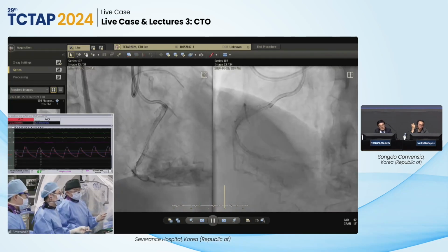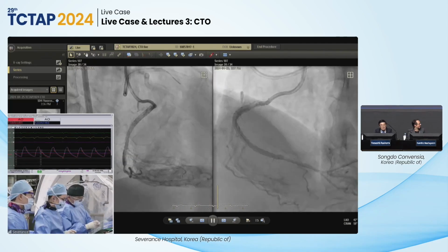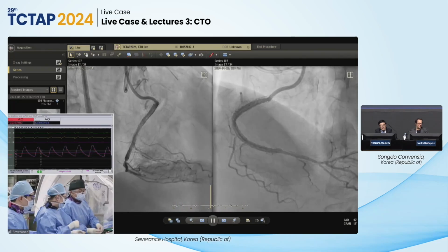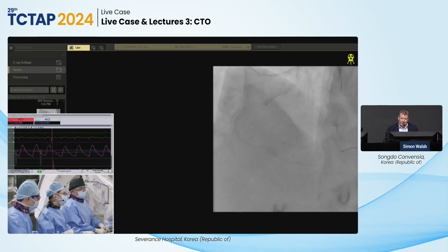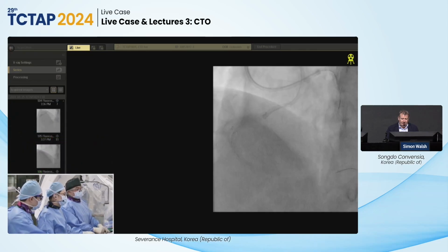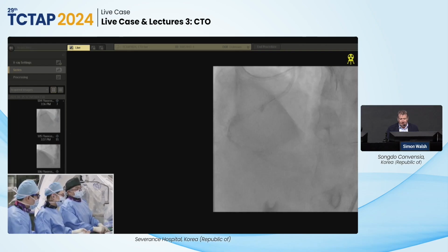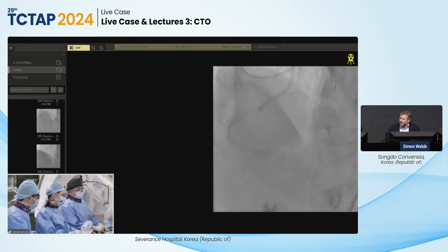I know it looks more beautiful when you put a stent, but it's not relevant, in my opinion. Right. I think you could chase that from here to the end of the rainbow and not make this beautiful. You could use DCB. I think we're in a happy enough position. The side branch, interestingly, still has slightly reduced flow. I don't know if anybody would chase after that or not.